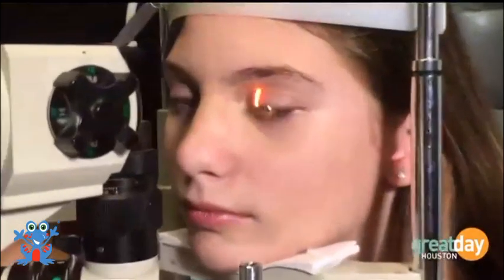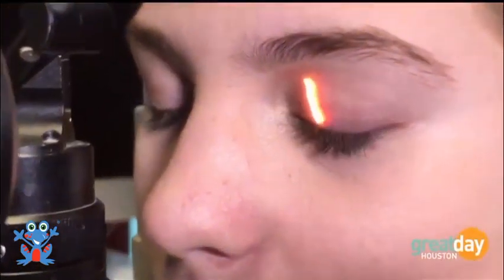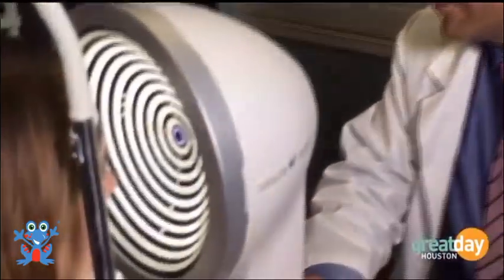But what we're finding now with corneal molding is not just that you can see with your naked eyes, with nothing in your eyes. What's most important is that we're now able to stop progression of myopia, slow down progression of myopia. Because her eyes are getting worse every year. And that's the problem. Kids are simply getting worse.